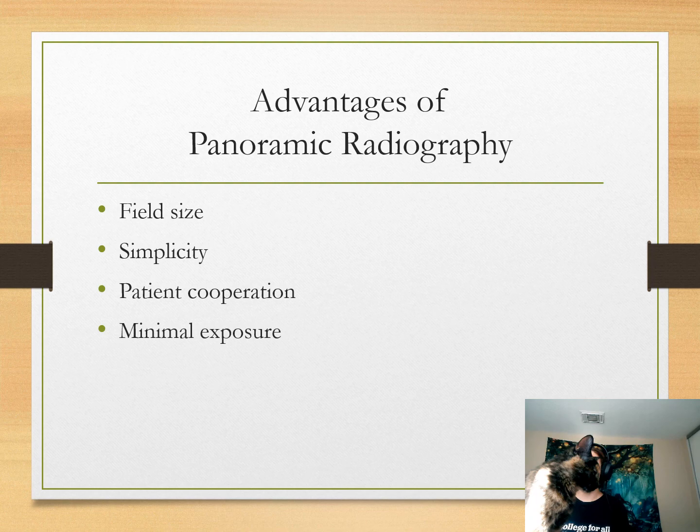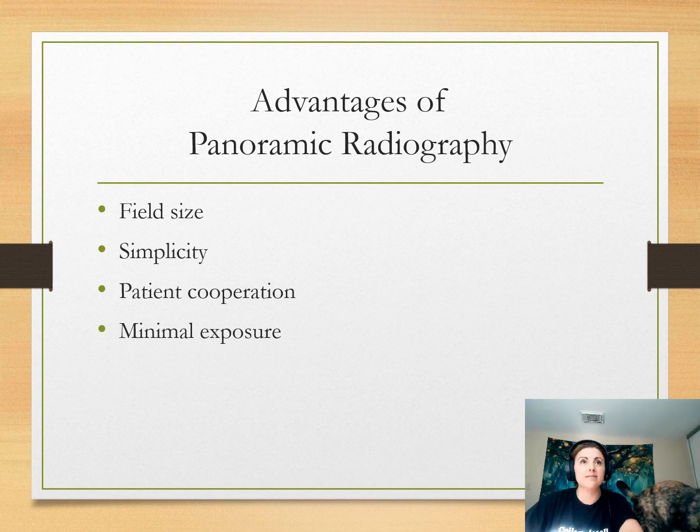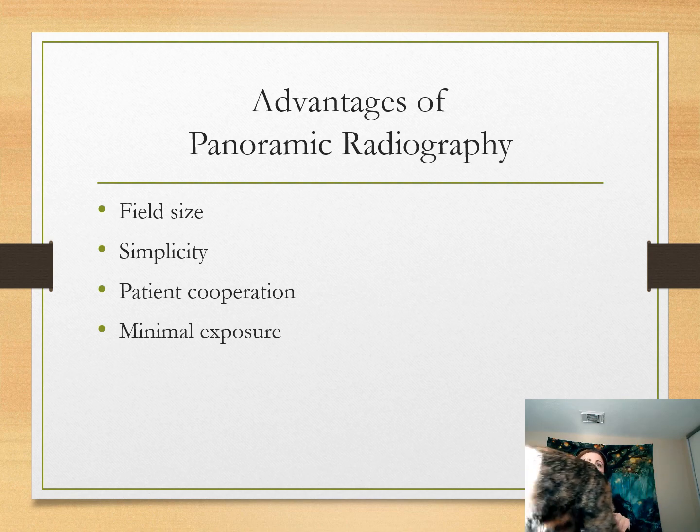And then also when we take just this one panoramic with some bite wings, it's actually much less exposure than if we were to take numerous FMX images. So a lot of those structures are on the image at one time.